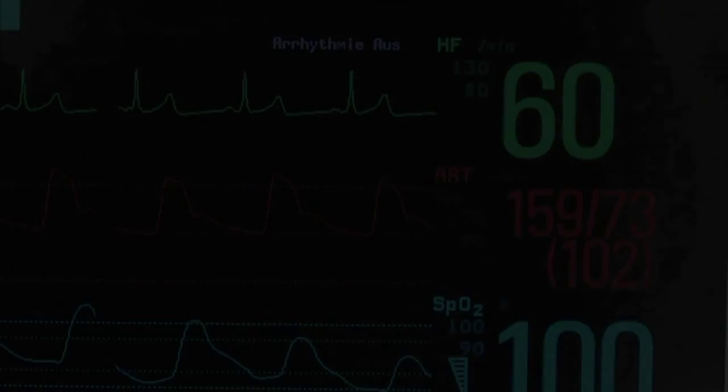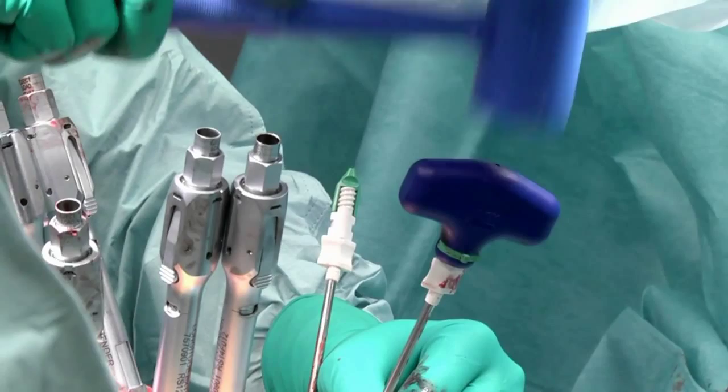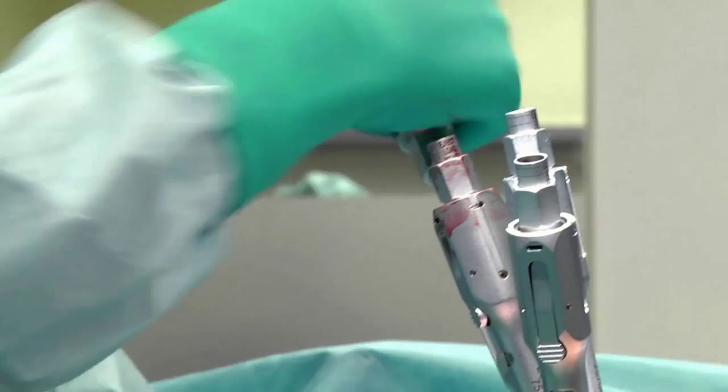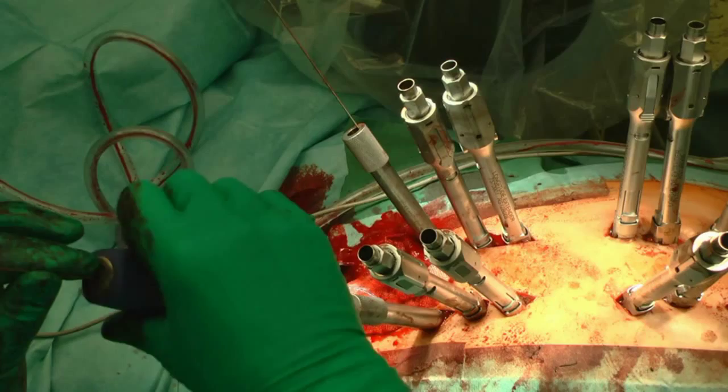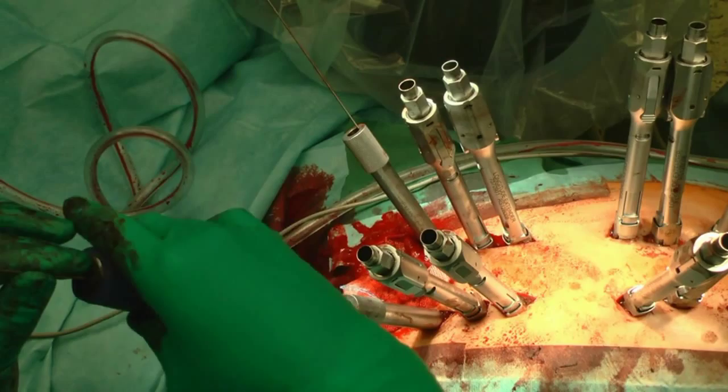The purpose of this film is to understand the indication and technique of percutaneous stabilization for fracture treatment in ankylosing spondylitis.